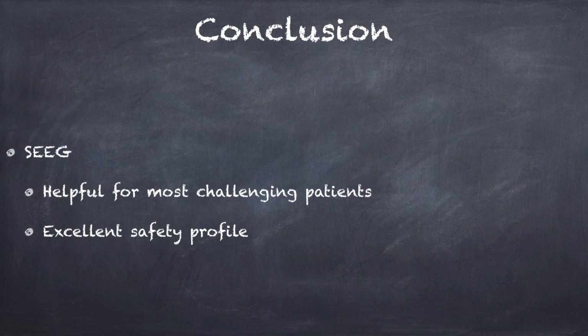We can conclude that SEEG contributes to excellent results on seizures in the most challenging patients suffering from drug-resistant focal epilepsy, and its efficacy and safety profile justify the widespread use of this methodology.